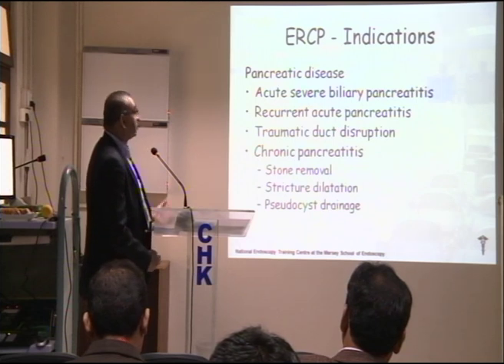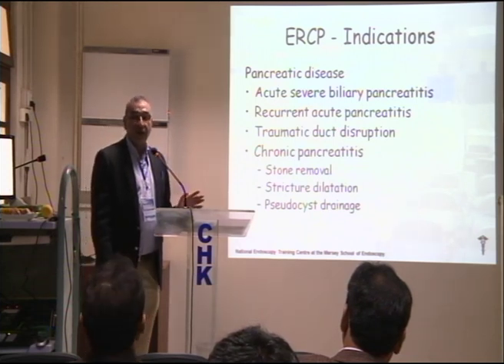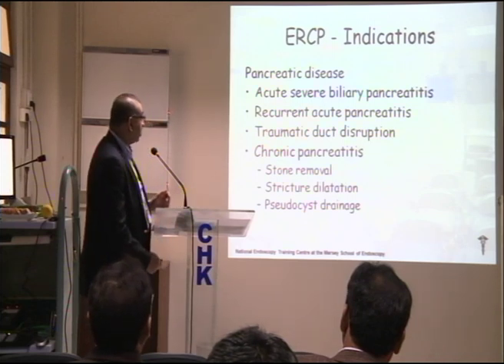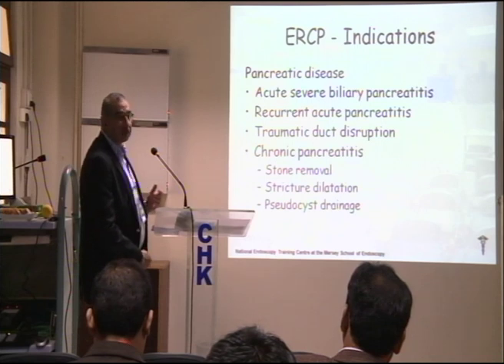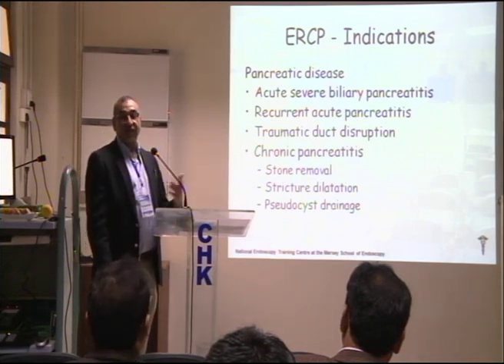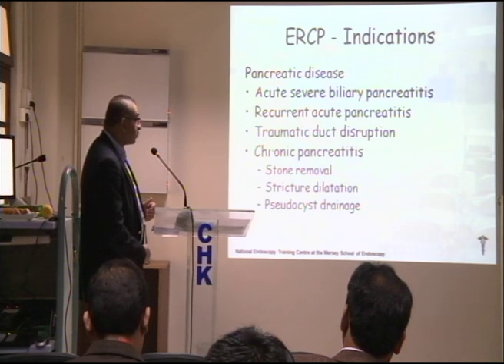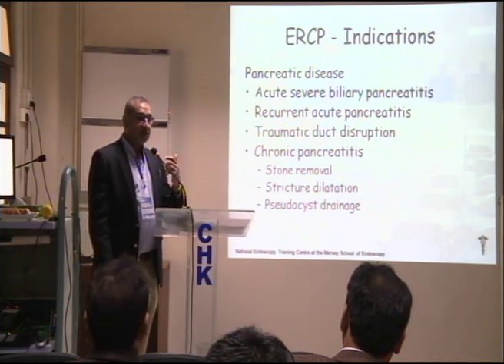Traumatic disruption, again, a job for the expert. Not everyone can do it, and we usually come across these cases, especially in my practice, in patients with road traffic accidents, because they end up with quite severe pancreatitis and duct disruption. We usually stent those patients. Quite a rewarding procedure, but to be done by experts.